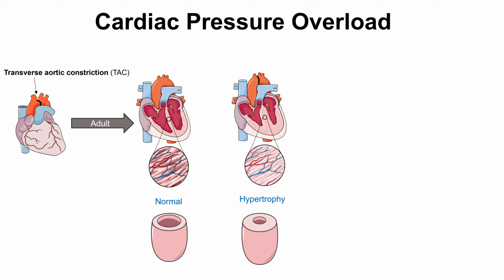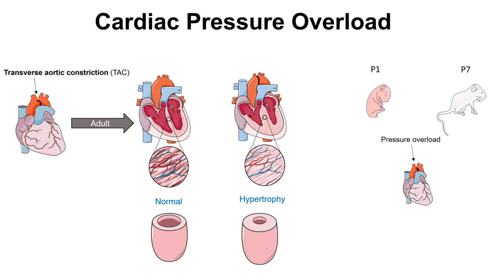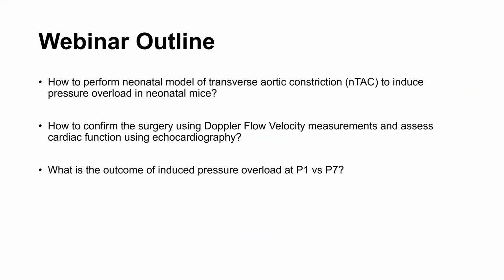To decipher whether regenerative mechanisms in neonatal mice could promote compensation of pressure overload, I have established a neonatal model of transverse aortic constriction at postnatal day 1 and 7. Within this webinar, I'm going to show you how to perform a neonatal model of transverse aortic constriction to induce pressure overload in neonatal mice.